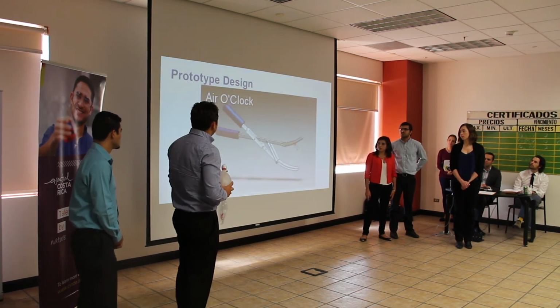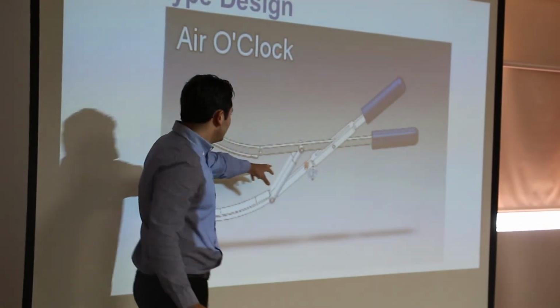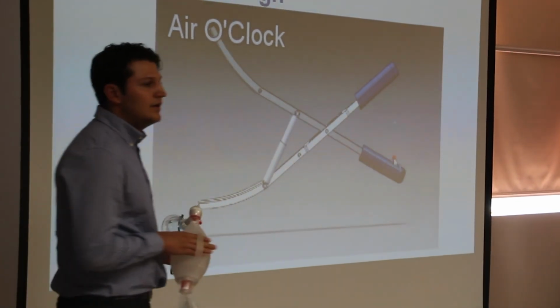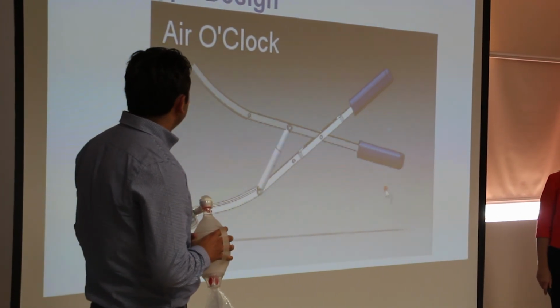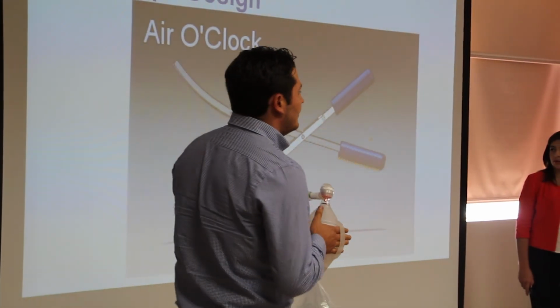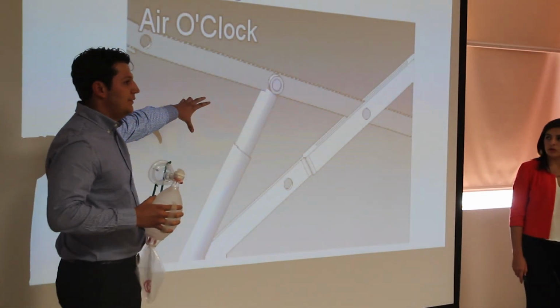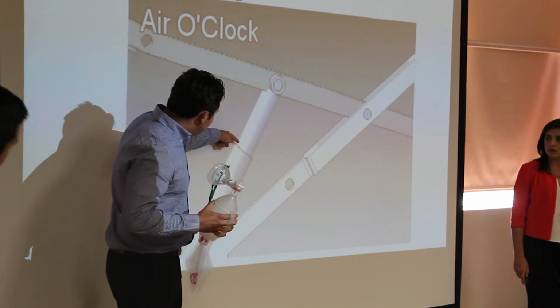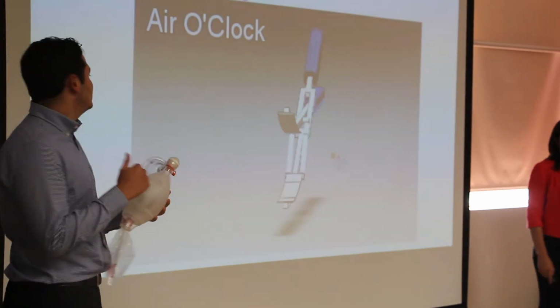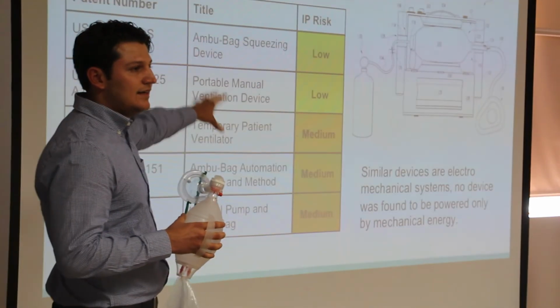This is a video of the design that we made, explaining how it works, so you can see it in a better way. These are the dashboards, the handles, the way it's going to move. So I think you can see it's functional. So we consider that it's a good idea. This is the detail of the dashboards that we are going to use. The limits are going to be set in this part, so the dashboard cannot go longer than what we set. So that's our CAD design.